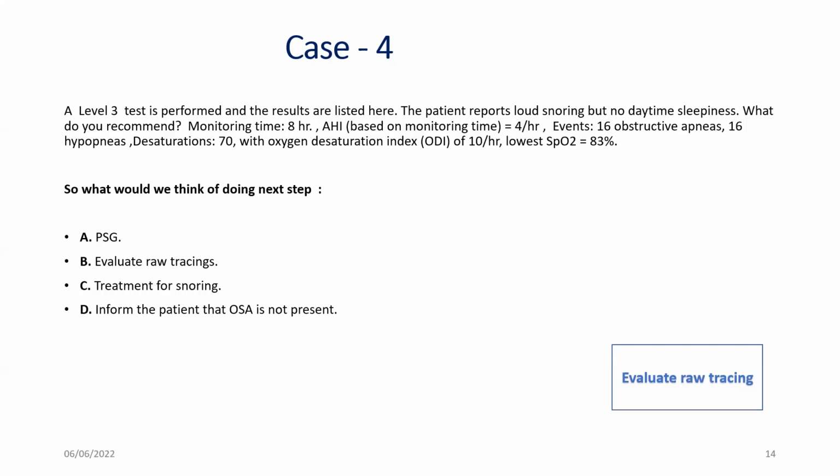There is one more point I want to add, Mr. Pankaj. Here you can recommend your patient to go for PSG, because if your patient already has a COPD-like condition, it may be possible that these desaturations are due to COPD.